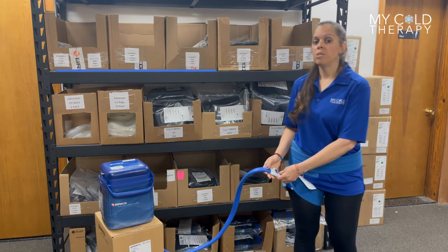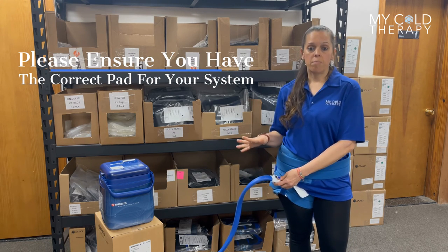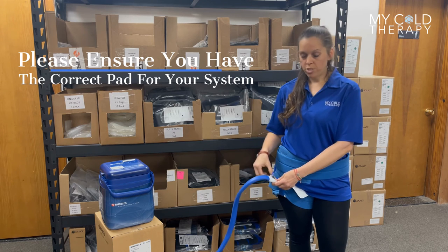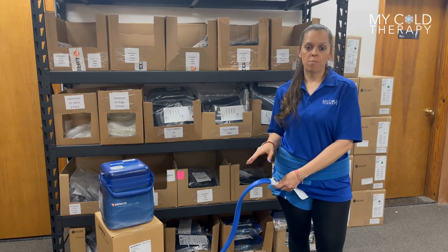One thing to keep in mind: between the PolarCare Cube and PolarCare Kodiak, the pads are not interchangeable. They do have different connections, so always make sure you know which system you have so that you get the correct pad.